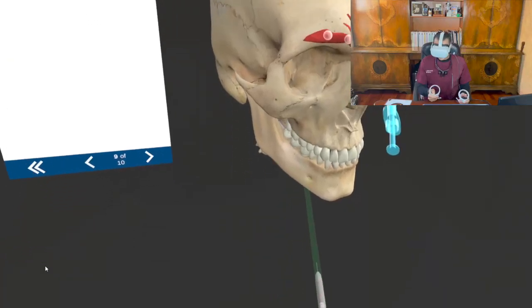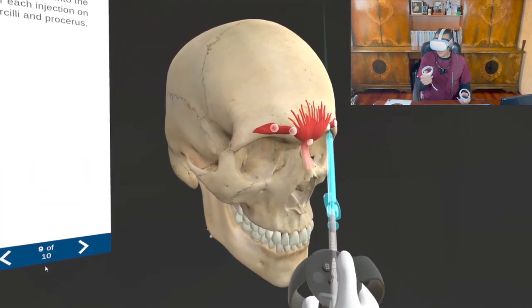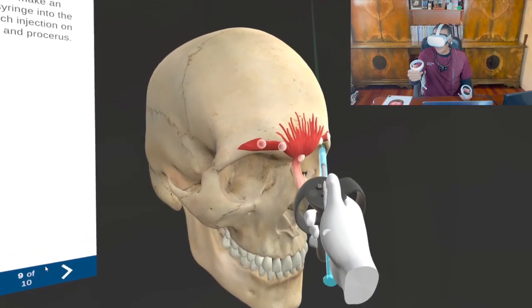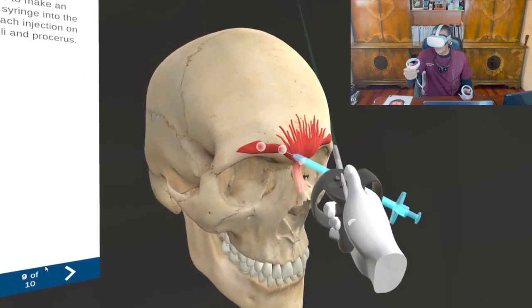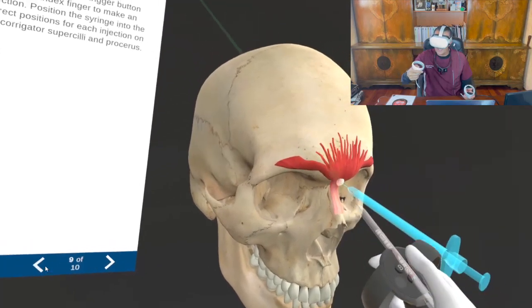Here I have the syringe of Unitox in my hand and I'm trying to inject into the corrugator muscle. This time my direction and my dots are already designed for me, and as I line it up it will make a noise so I know I'm injecting in the right direction into the right muscle. It is that easy.